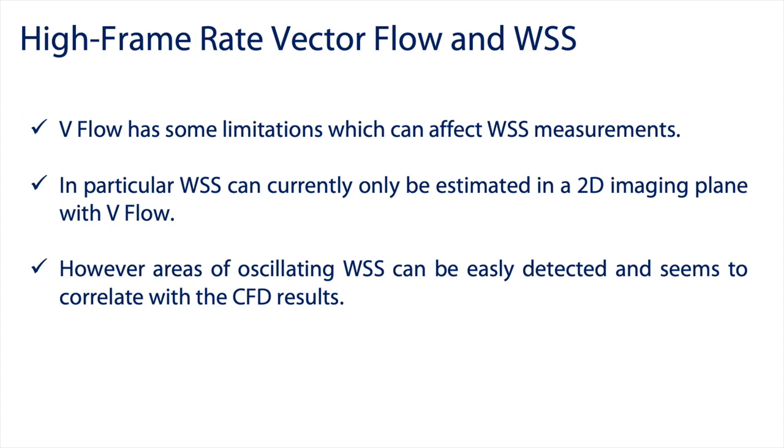Preliminary research findings are encouraging and show that high frame rate shear stress values seem to be comparable with the CFD shear stress ones. And if the preliminary findings are confirmed, high frame rate vector flow could identify patients at a high risk of plaque development or plaque rupture.